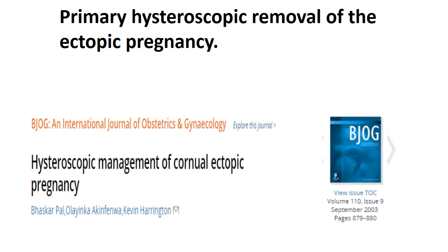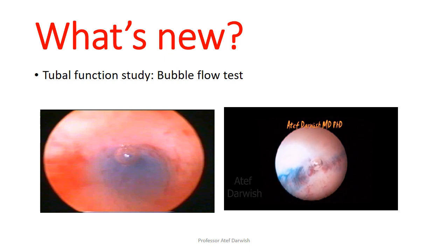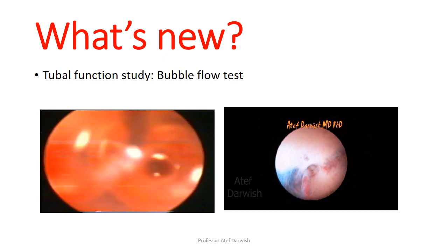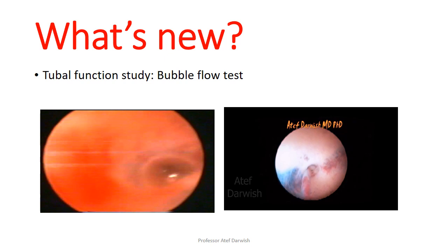Some scarce studies describe hysteroscopic removal of cornual ectopic pregnancy via hysteroscopy. All these procedures and more can be achieved when you concentrate on this part of the fallopian tube via hysteroscopy. What's new in this field is tubal function study, like the bubble flow test, which tests patency by observation of the passage of air bubbles inside the tubal ostium — or non-passage in cases of occlusion. As seen in the video, on the right side there is an organic cause — a fine polyp inside the intramural part — preventing air bubbles from crossing to the proximal fallopian tube, representing a negative bubble flow test.